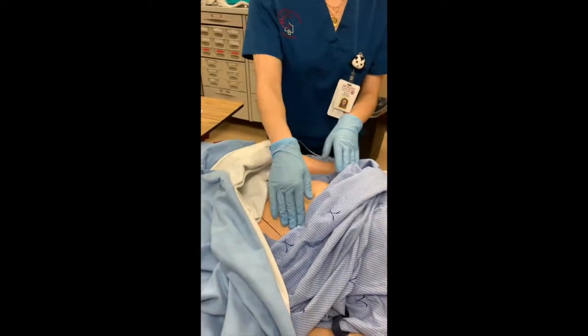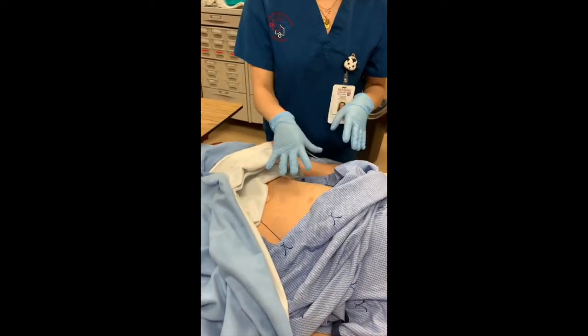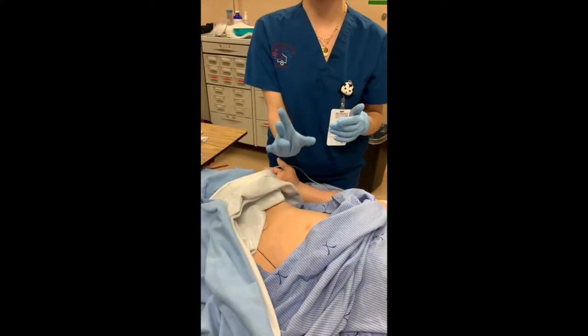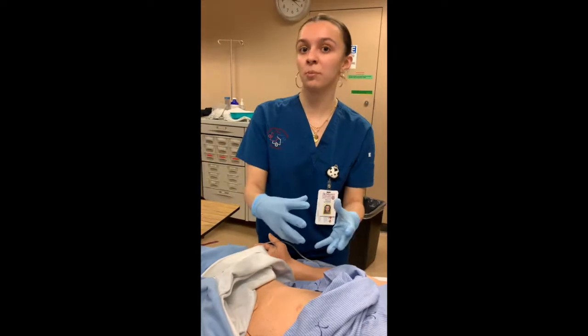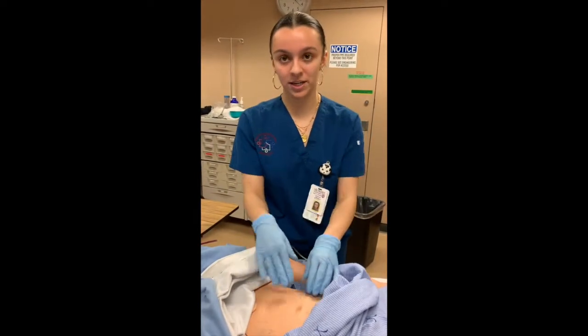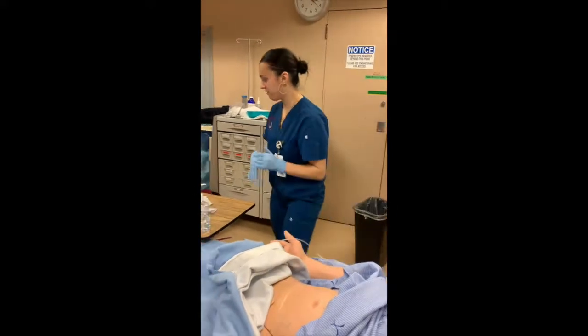So now what I'm going to be doing, also with the subcutaneous, you want to be giving it at a 45-degree angle just to ensure that the medication is going through properly and reducing the amount of pain you're going to be giving for Mr. Mancini. So we're going to be doing that first.